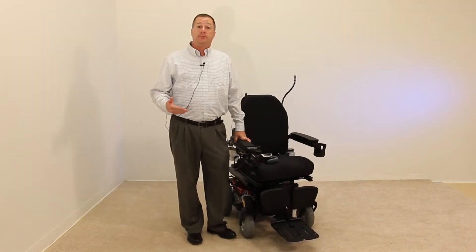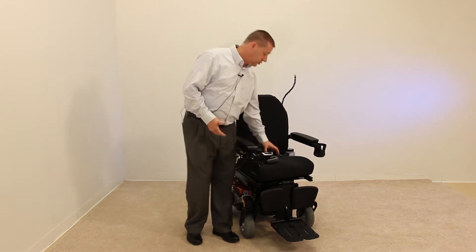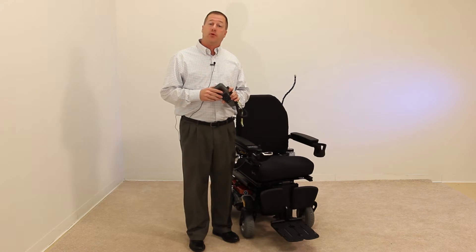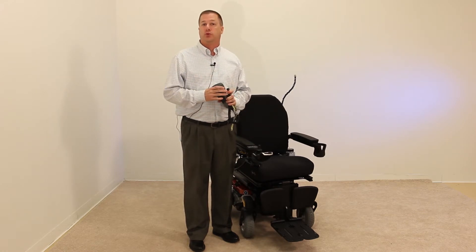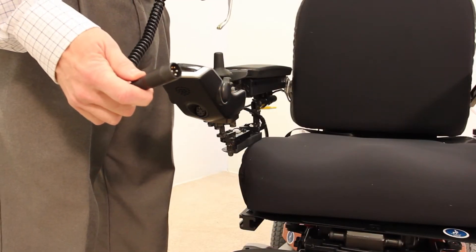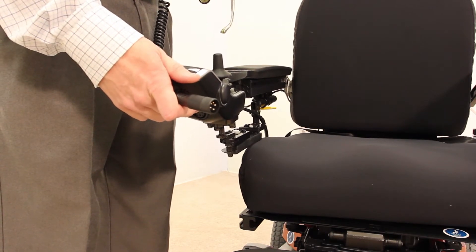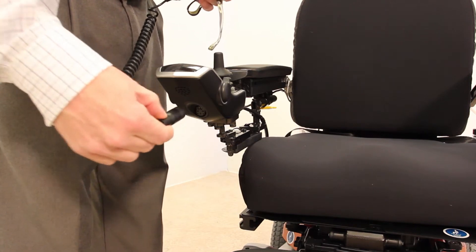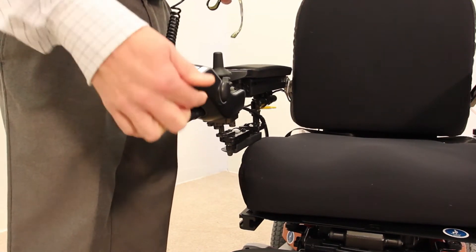The first step to setting up your Q-Logic 2 hand control Bluetooth is to utilize your handheld programmer, plug it into the system, and take one of your five drive profiles and make it an auxiliary profile. In order to plug the barrel of the programmer into the charger port of the Q-Logic 2 hand control, take the thumb notch on the barrel, make sure it's facing up, and slide the barrel into the receiver.